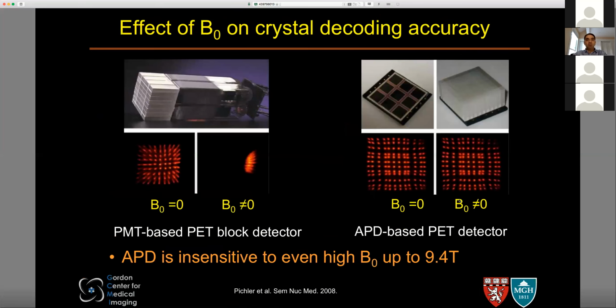It took a long time to build PET-MR scanners, and that is not because people are lazy and they weren't working on it. It's simply because it's a much more complex physics problem to solve, an engineering problem to solve, than it was for PET-CT. The reason for that is, as you remember from Johan's lecture last week, in PET-CT we have crystals here, light, so photons are coming this way, absorbed, a light photon is propagated here, and then it hits a photomultiplier tube where it's amplified, and basically that's a vacuum tube where you have electrons that are being amplified, more and more electrons, and then they are read at the end.